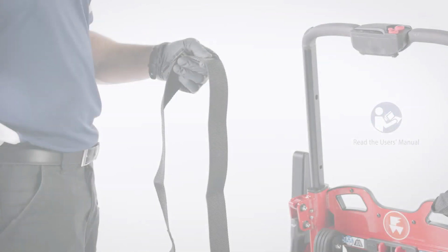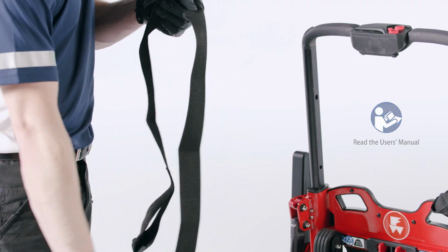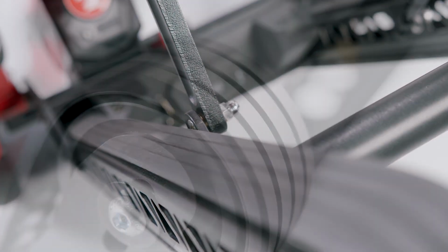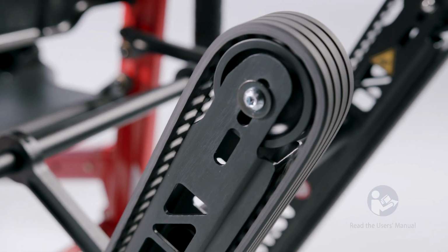To clean the restraints, remove them from the chair. Clean only as directed in the user's manual provided with the patient restraints. It's important to keep the track and belts free of oil, grease, dirt, and debris. Clean only as directed in the user's manual.